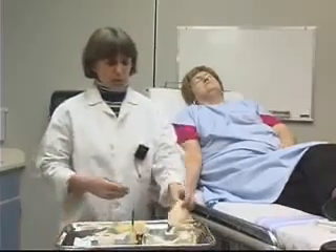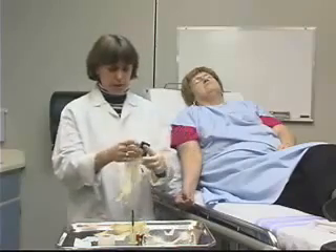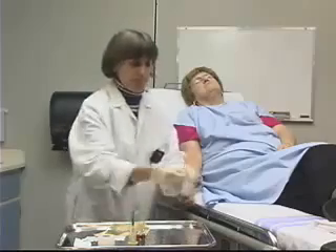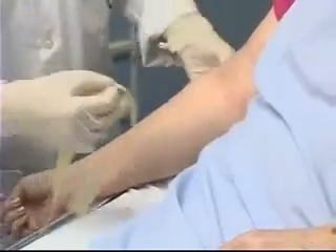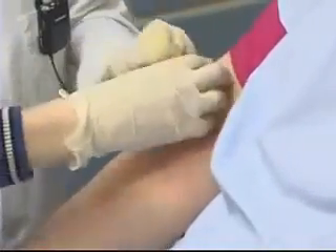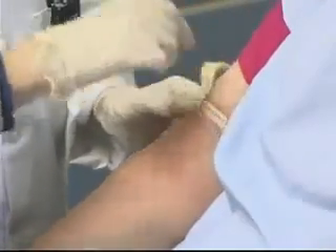As with all procedures, we're going to use universal precautions, and for this procedure they include protective gloves and protective eyewear. The site I've chosen is the antecubital, so I'm going to apply the tourniquet to the arm approximately three inches above the antecubital fossa, and I'll put that on like so.